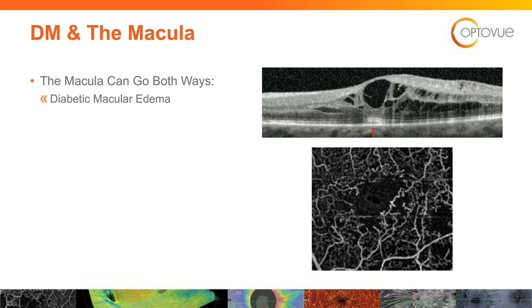Have you ever had a long-standing diabetic that has had cataract surgery and was 20/25 or 20/30, and you looked at the back of the eye and said, there's no exudates in the fovea or the macula, there's no bleeding in the macula, why is their vision only 20/25 minus or 20/30? And then maybe you did an OCT scan and it was a little bit thin. Well, I'd challenge you to think about, do they have diabetic macular ischemia?